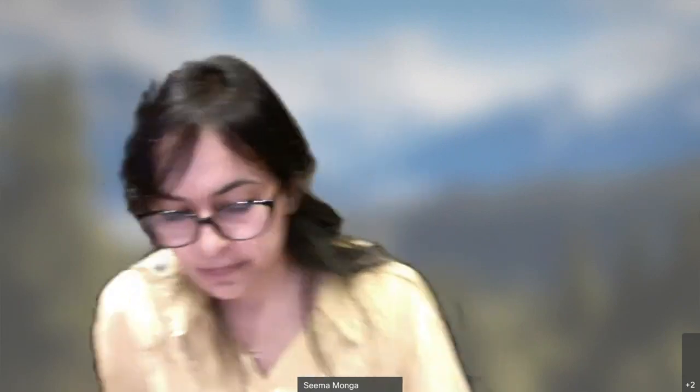So if both OAE and BERA are normal, obviously if it is an adult, you can do speech audiometry. One important thing to remember is that pure tone audiometry and speech audiometry are actually testing your hearing. Hearing means understanding the sound you're getting, while in OAE and BERA, you're just checking that the ear and brain are functioning. In speech and pure tone audiometry, you're actually understanding, like when you give a sound to a mother that the baby is crying, it shows that the mother understands the baby is crying.